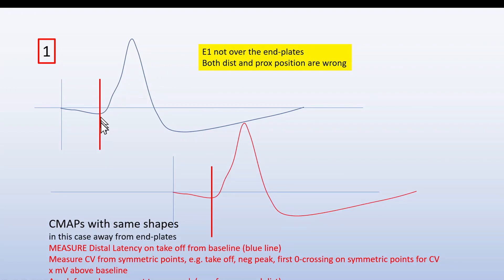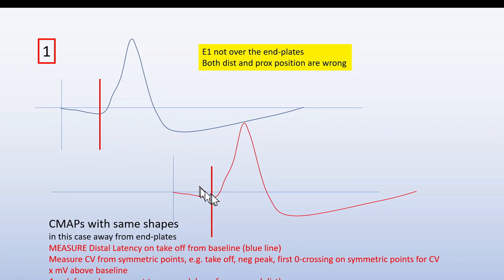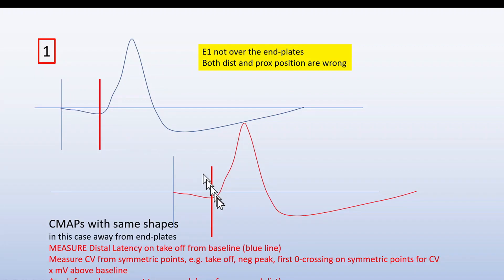Here I've set it to the positive peak here and the positive peak here. Usually the conduction velocity can be calculated very accurately, and we may have problems mainly with the distal latency. This is when the signals are identical, more or less.